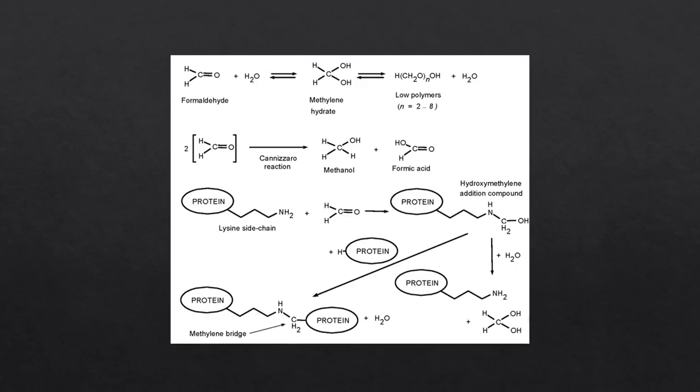However, fixation works by a process called cross-linking. Formaldehyde is an extremely reactive molecule that forms polymers in aqueous solutions. These polymers form bridges between amino acids and proteins. Thus, proteins stop functioning but retain their structure even after dehydration. Since a huge part of protein folding is hydrophobic interactions due to an aqueous environment, dehydration of the cell can completely change the folding structure of a protein. Formaldehyde cross-linking bridges prevent the structure from moving.